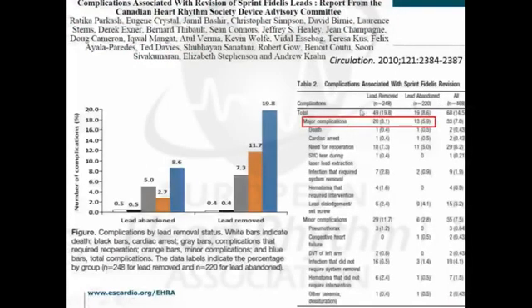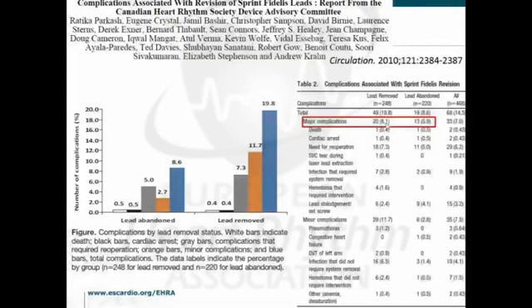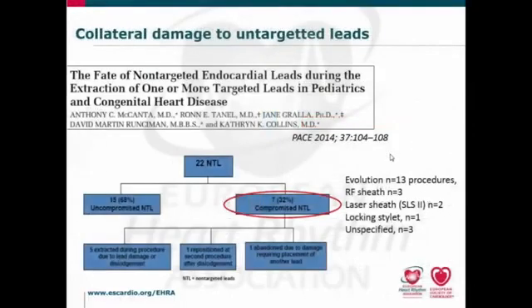We know that lead extraction has complications. We'll be seeing a lot of complications over the next 2 days. This is just from a registry with Fidelis lead extractions, where there were about 8% major complications.